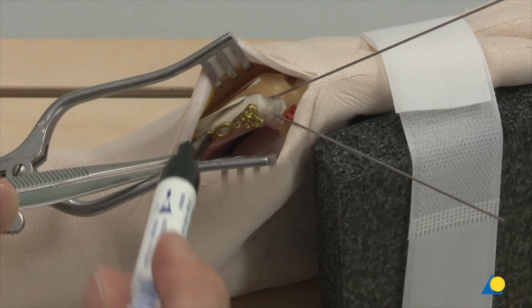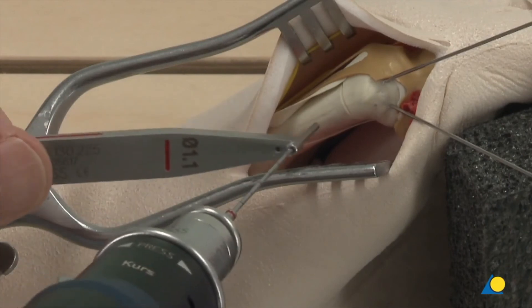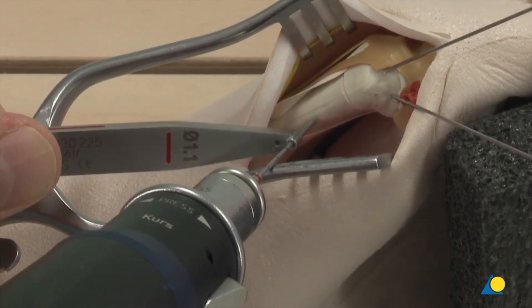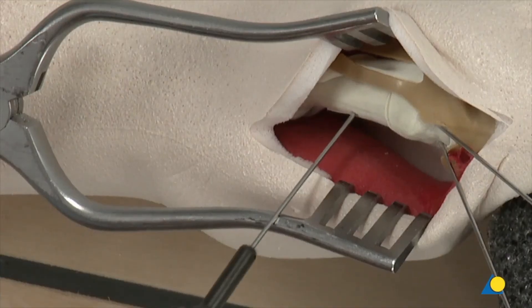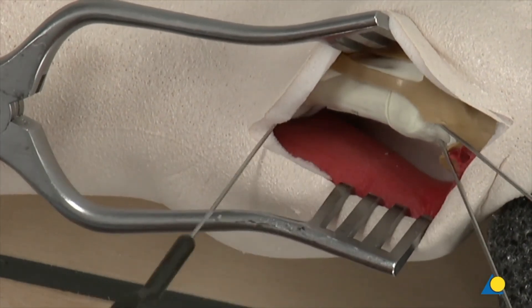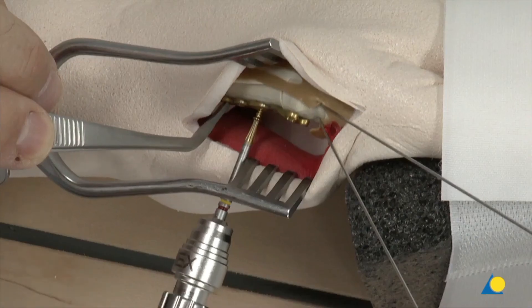The first hole is marked on the bone through the elongated hole of the selected plate. The hole is drilled through both cortices using the 1.1 mm drill bit and 1.1 double drill guide. The depth is measured, the plate is held with the plate holder, and the first cortex screw is inserted through the elongated hole.